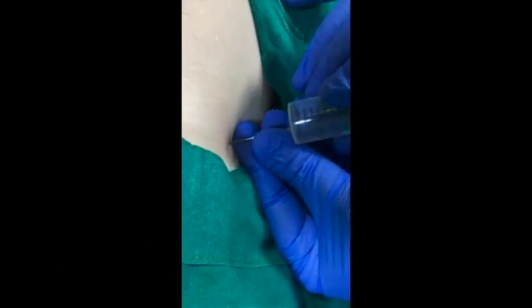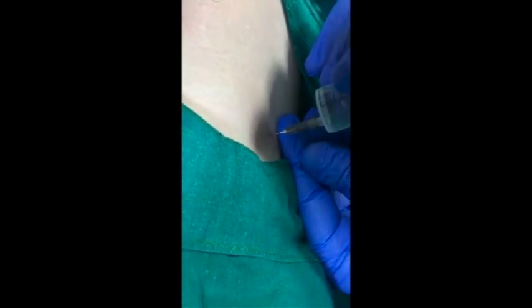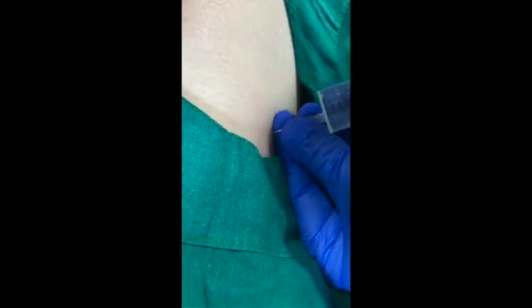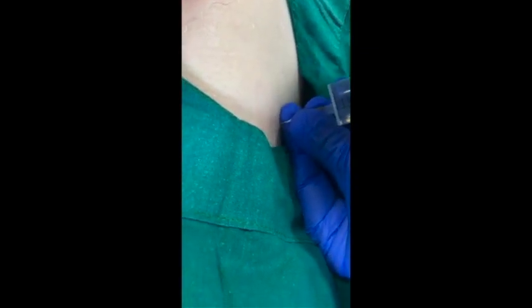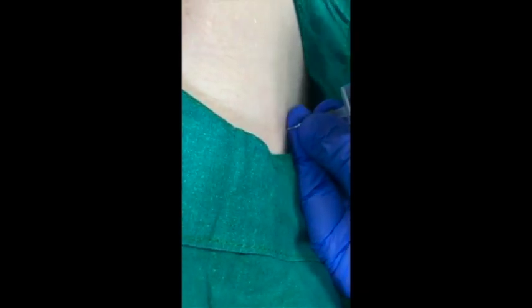Again I am feeling the bounce of the external oblique fascia, then pop, then again I am advancing the needle, bounce and pop. So after 2 pops, I will inject the drug in this plane, and it will become my subcostal TAP block. Again I am aspirating and injecting, and this is how you can give a subcostal TAP block.